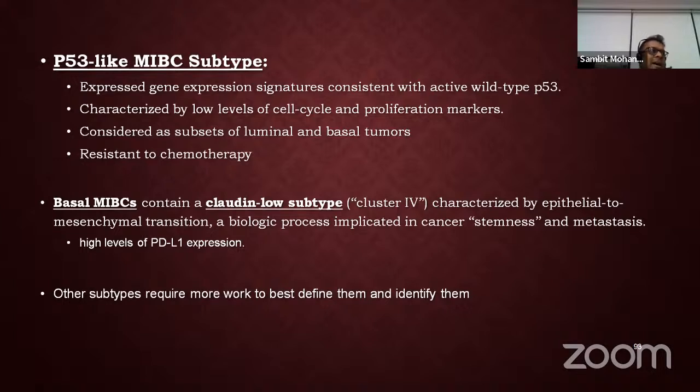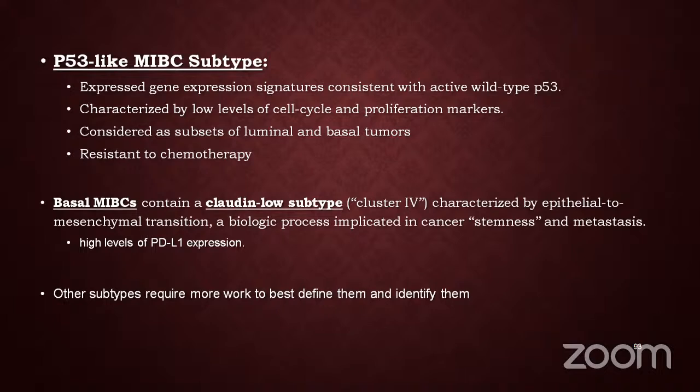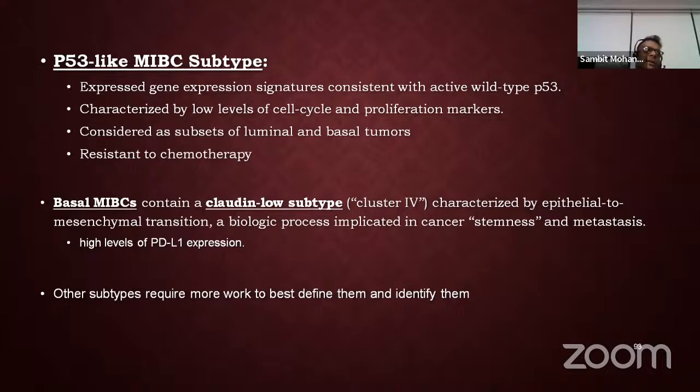After coming back to India, my threshold for low grade has increased. So I'm giving more low grade. I do not give any PUNLMP diagnosis. I give either low or high. So either papilloma or low grade carcinoma. Papilloma, low grade, very clear. High, yeah, very clear.